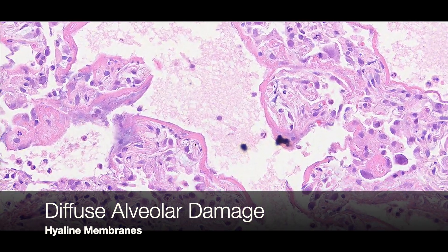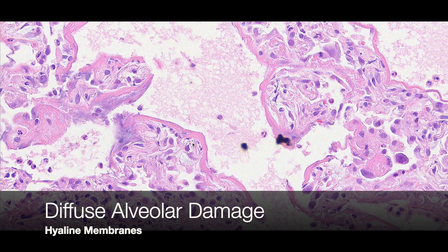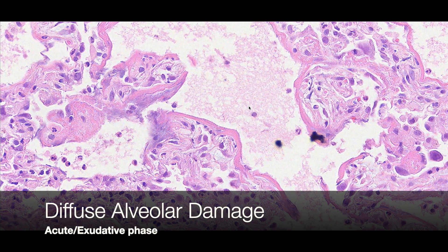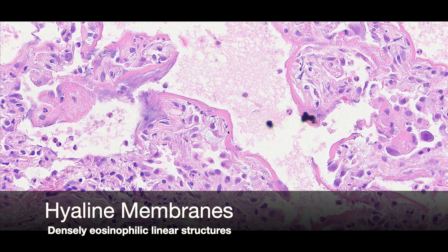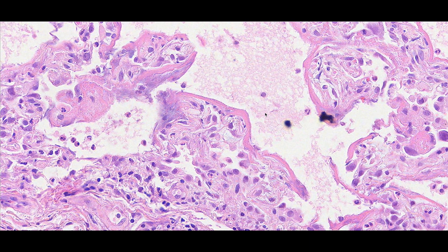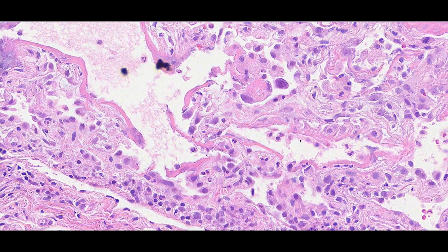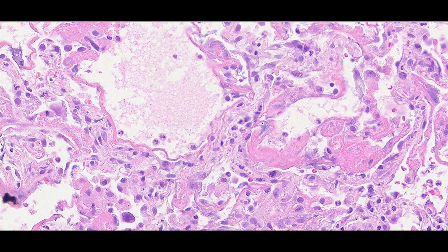Zooming in, we can see the hyaline membranes quite nicely. Hyaline membranes are the major hallmark of the acute or exudative phase of diffuse alveolar damage. As you can see, they are thick, densely eosinophilic material lining the alveolar walls in these linear structures. I was taught that it looks like someone took a tube of pink toothpaste and smeared it inside the alveoli — I think that's a really good way of understanding it. There are several nice hyaline membranes visible here.